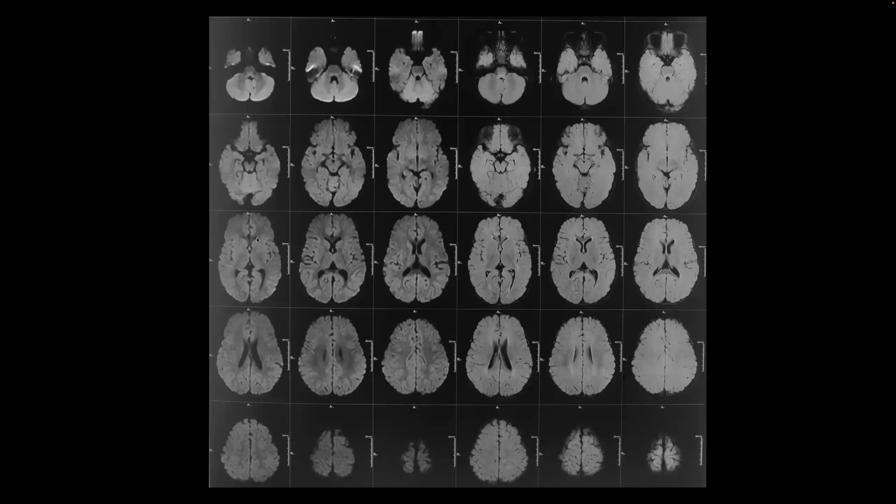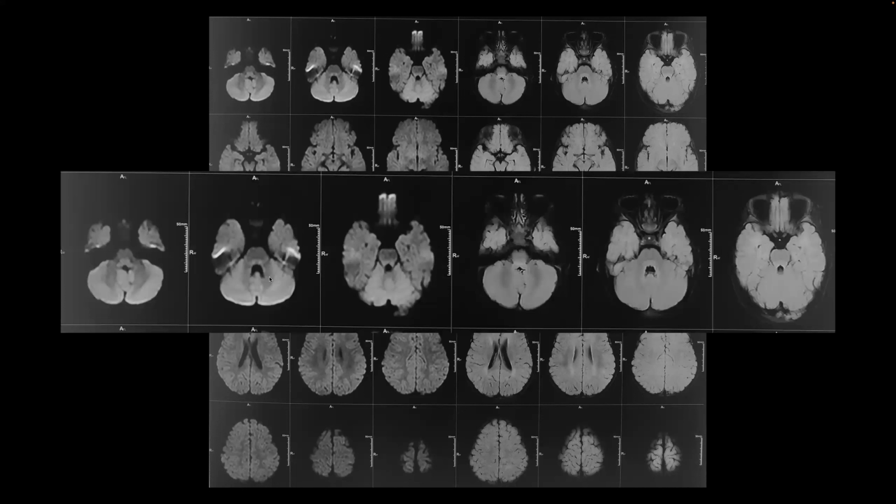Brain was done. I have only 2 sequences, that is the diffusion and the FLAIR sequences. The only abnormalities I could find were these changes along the dorsal brainstem, the central tegmental tracts, and the dorsal pons and the medulla, which demonstrate some degree of edematous changes.